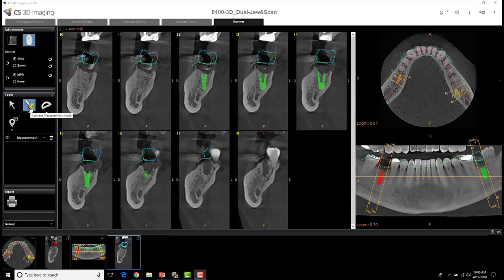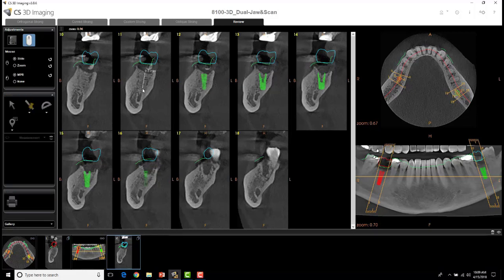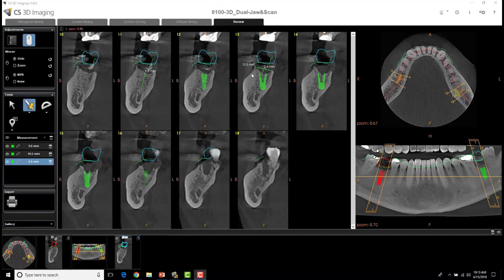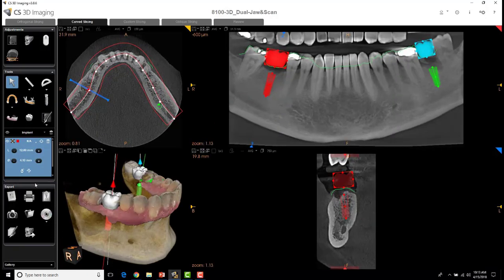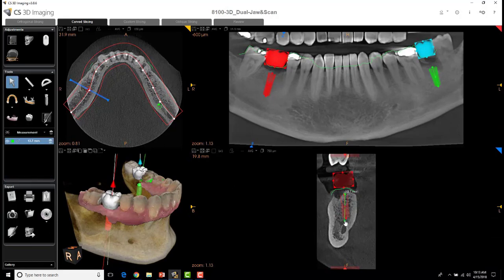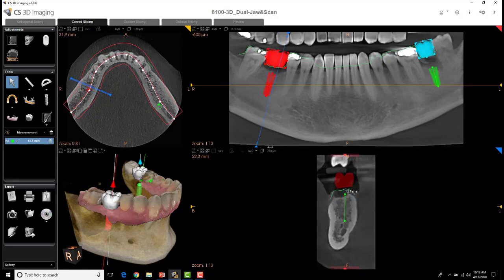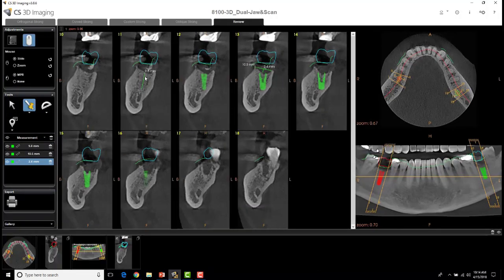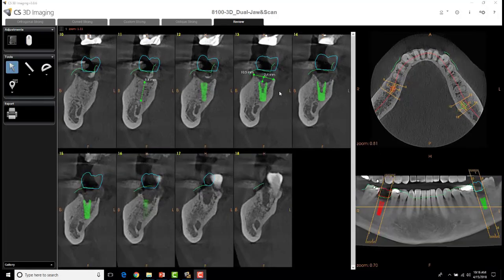What else can you do in these views? You can actually take measurements — multiple measurements — that stay attached to the individual slices. I can take a measurement anywhere, and that measurement now stays attached to that individual slice. Maybe I want to take another measurement to visualize how much bone reduction I need to do. Contrarily, if I'm in my normal curve slicing tab and I take a measurement of 13.7 millimeters, when I move my cross-sectional view somewhere else that 13.7 millimeter measurement comes with me, making it difficult to take measurements in multiple areas of the scan for future reference. What the review tab does is those measurements now stay attached to each individual slice.